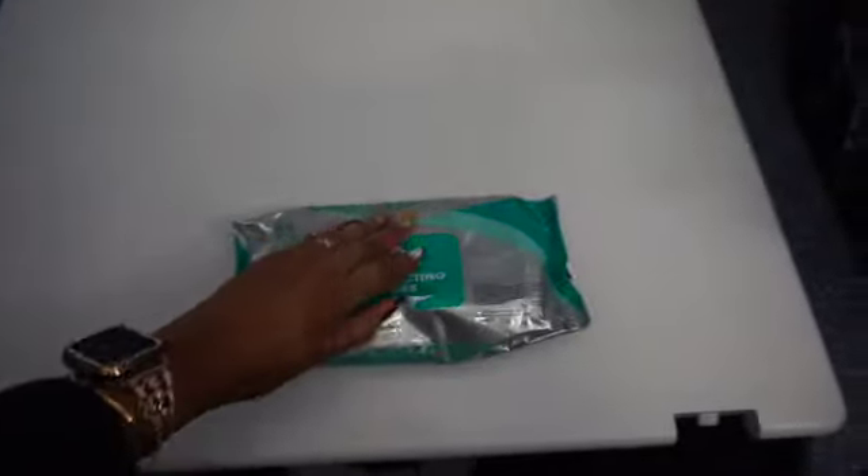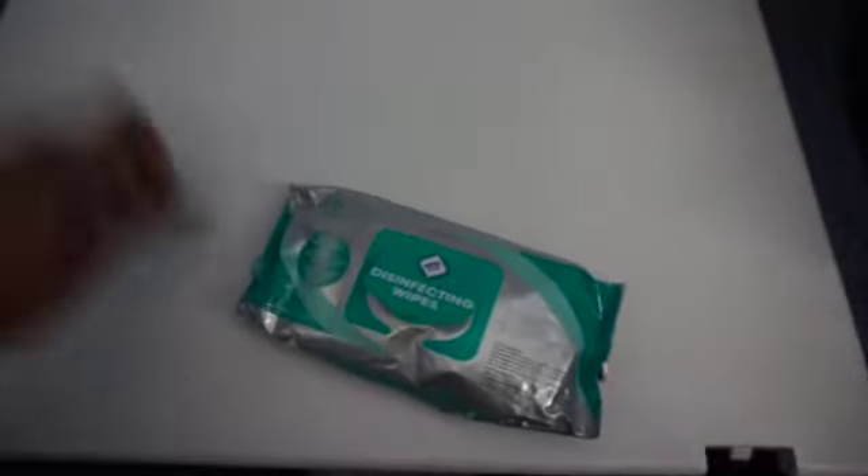Cheers! So here I am in a teeny tiny airplane lavatory. I would recommend using the lav that has a changing table — this part is pivotal. Really, really simple and easy: just ask the flight attendant for a garbage bag and bring some sani wipes or disinfecting wipes. Here I am taking my disinfecting wipes and wiping down this changing table, because the likelihood that these get cleaned is not very high. After I wipe down the surface nice and clean, I'm going to spread out my plastic bag for an extra layer of protection. You're dealing with your breast milk and your pump parts — you don't want any cooties or germs on there.